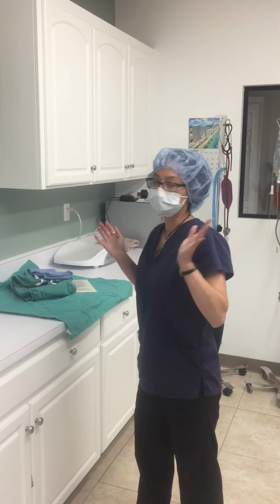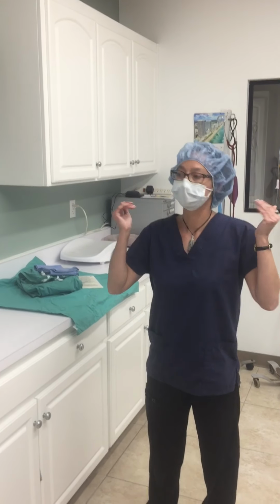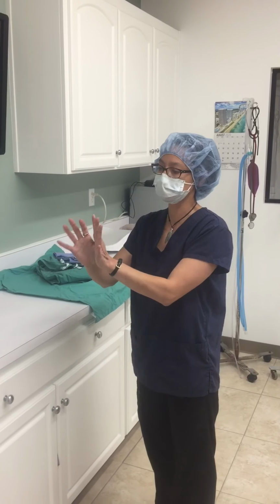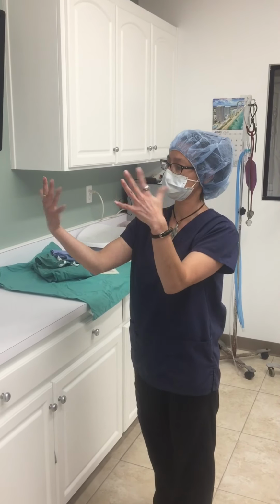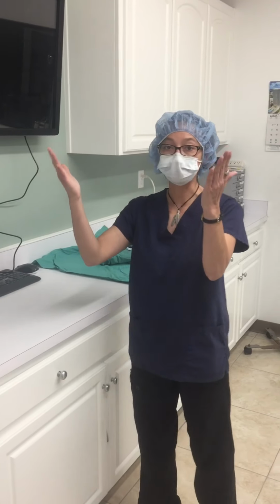Okay, we've got our cap on. Now usually after the cap is placed on, I've already got my mask on. We'll wash our hands thoroughly. We'll do a full scrub in between each finger and the hands. So as if we have just scrubbed and now my hands are wet from the scrub.